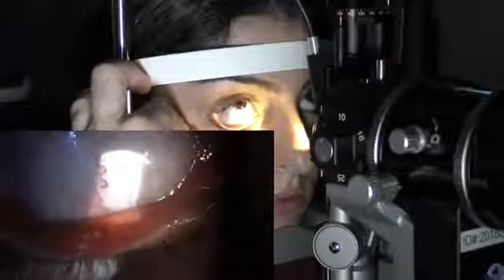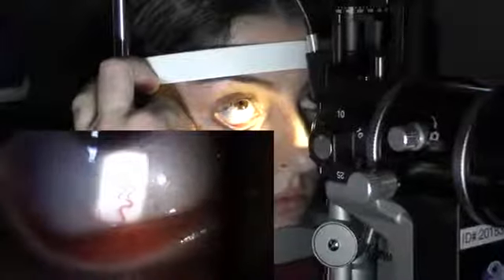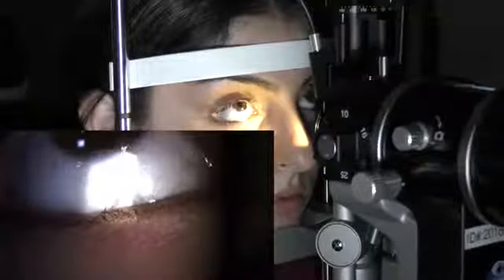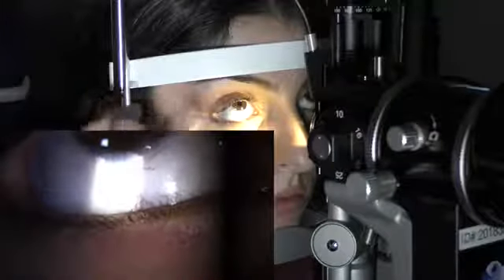Look up, please. As they look up, you can use the Q-tip again or your finger just to pull lightly down. And again, look at the bulbar conjunctiva, look at the vessels. Sometimes you can see some peculiar vessels. For example, if someone has a CC fistula, they can get vessels called corkscrew vessels that are corkscrew in shape. You can also get comma-shaped vessels in diseases like sickle cell disease. So it's very important to look at all the structures.